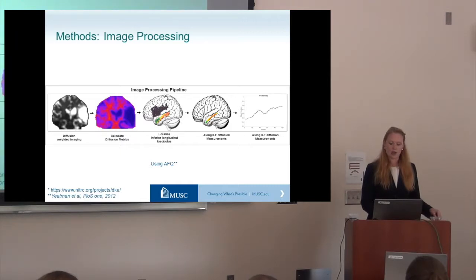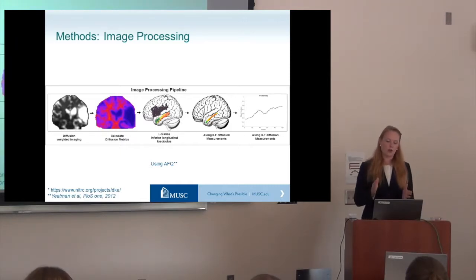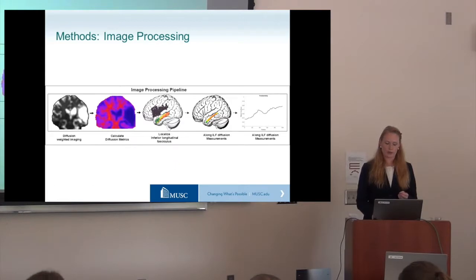Then they get chopped off at two well-defined places, which makes calculations a little easier. And then we compress this whole bundle into one average bundle, which you can see here on the right, and it's color-coded also with our kurtosis measurements.